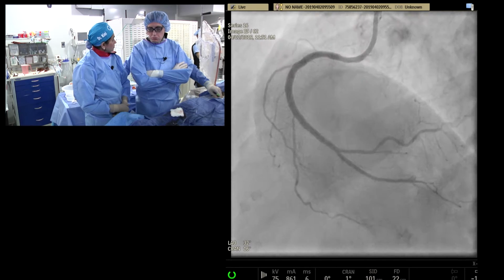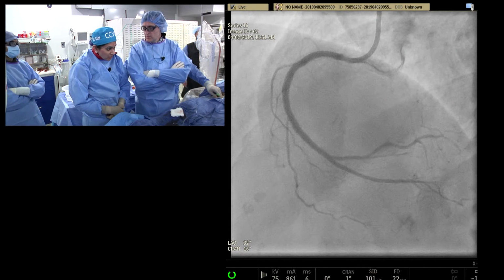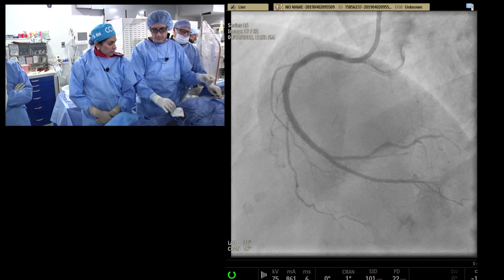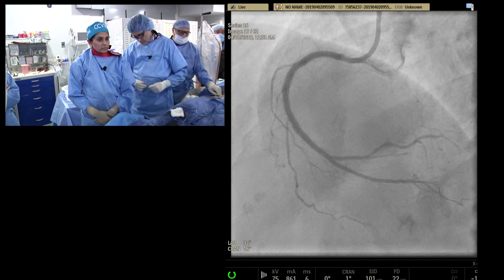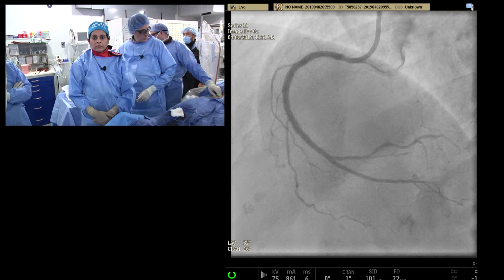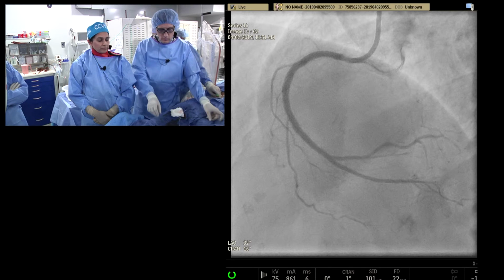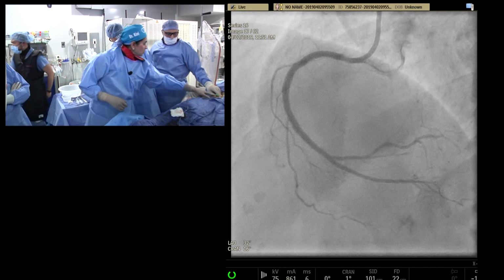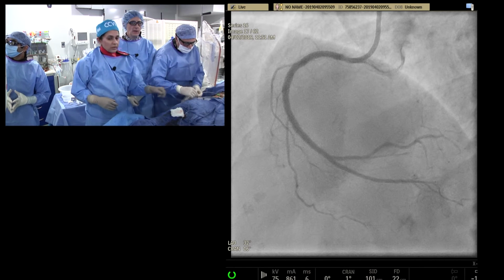Are there any questions from you? You have a great opportunity to ask a question about a percutaneous coronary intervention here with our operators. Any questions? Please feel free. Don't be shy. I know they look like they're smarter, but they're not. Any questions? Yes, please. One second. We're gonna get you a mic. There's a question from the audience, Dr. Dangus, Dr. Kinney. Yeah, we like questions.